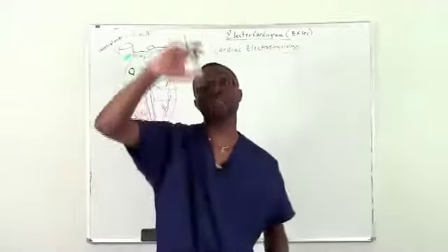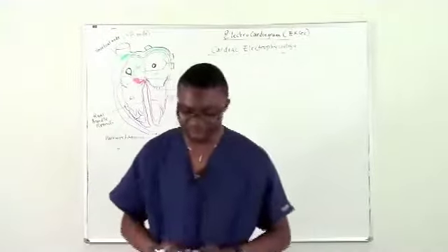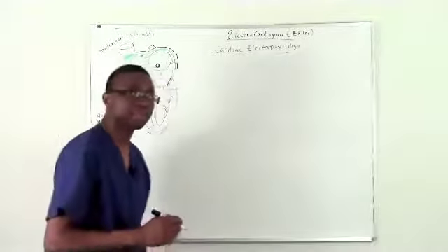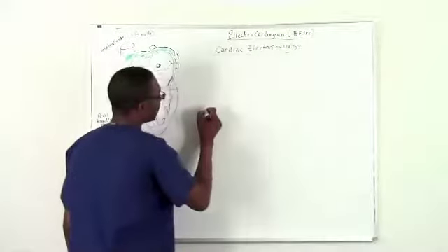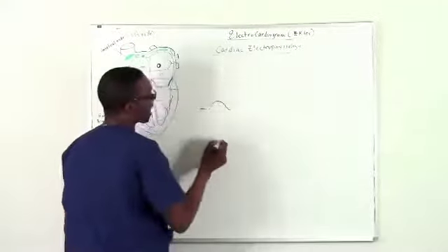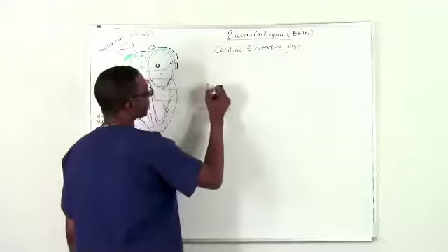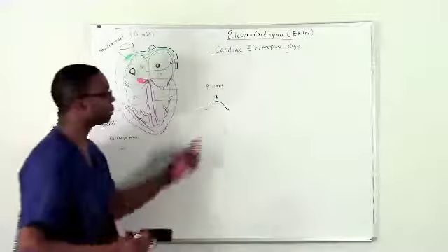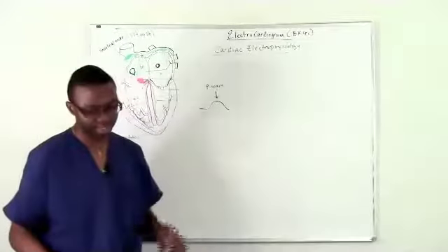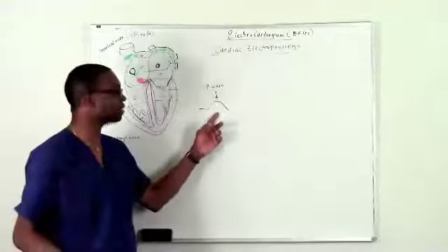You see something going up, something going down, and those are the things I'm going to try to decipher in this lecture. The first thing you see on an electrocardiogram is a line that looks like a bump that goes up like that. That is known as a P wave. The first upstroke, the curve that you see on an EKG, is known as the P wave.